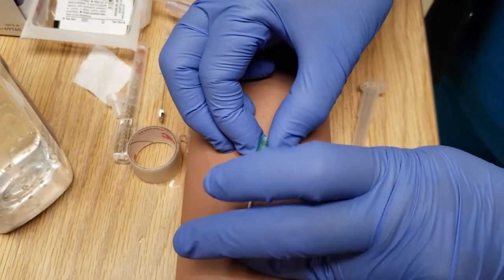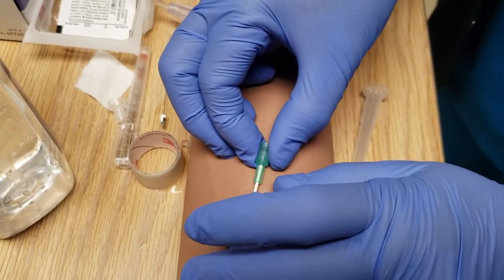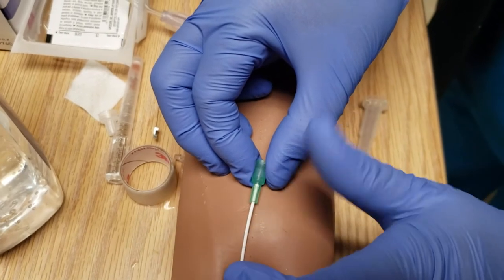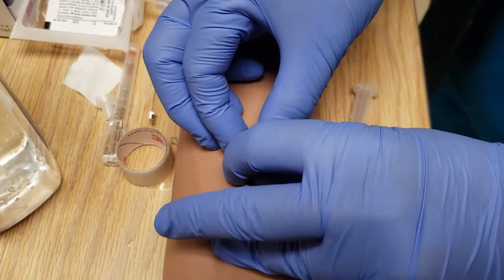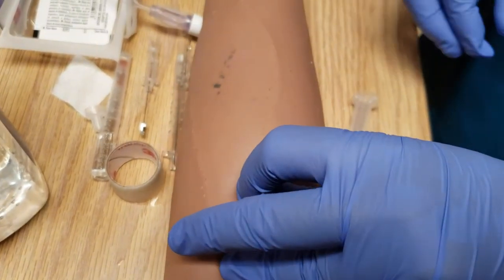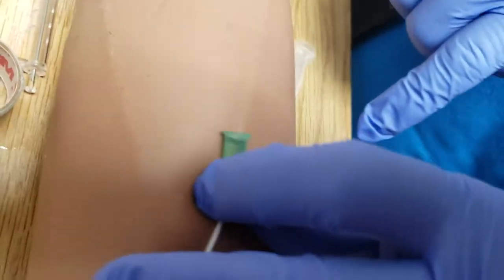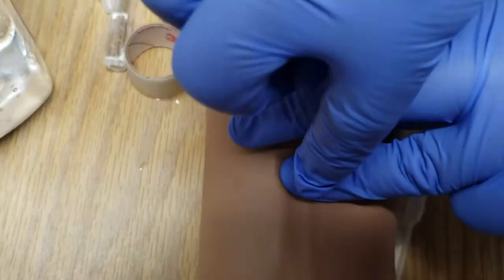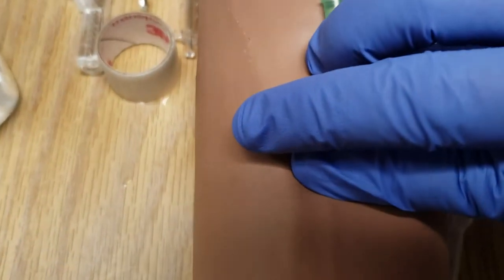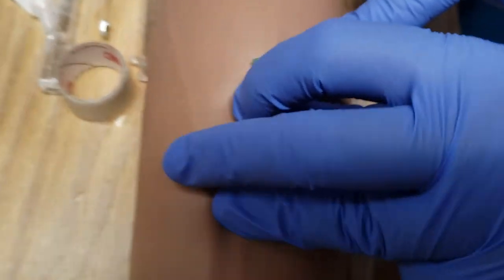I'm pushing down on this, and on some patients you might have to push a little harder. These two fingers, that's what I'm going to use to keep this in place. As you can see, it's stable right on the patient's arm and this shouldn't move. I'm still occluding on this side and keeping this stable on this side.